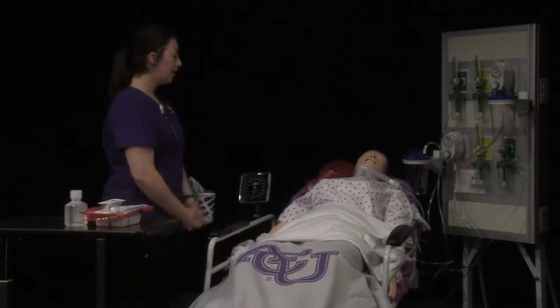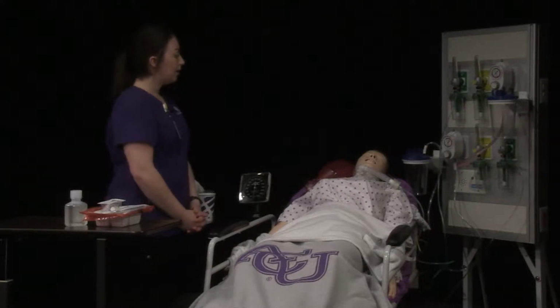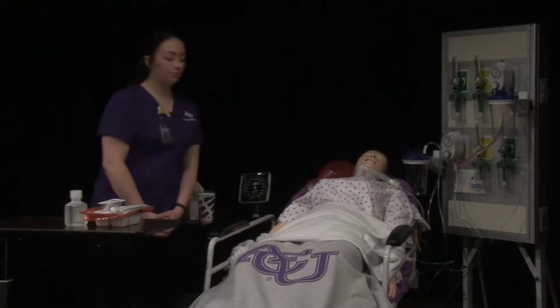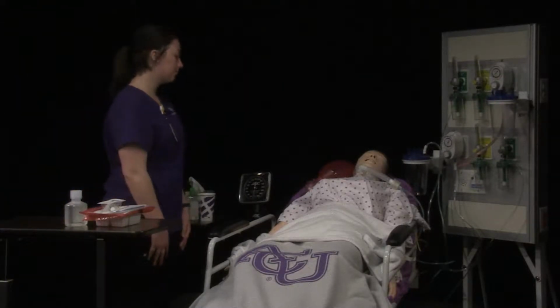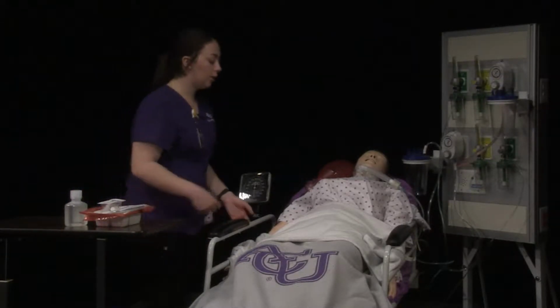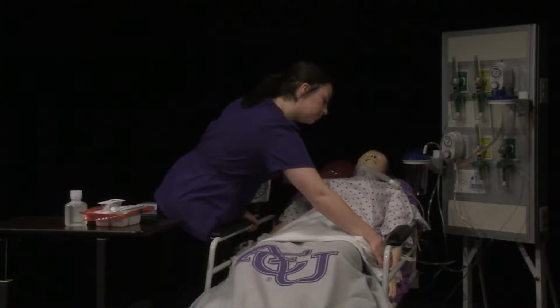Introduce self. Hi, my name's Sarah. I'm going to be your student nurse today. Provide for privacy. I'm going to go ahead and shut your door for some privacy. Identify the patient using 2 identifiers. Can you go ahead and tell me your name and your date of birth? Have the patient state their name and date of birth as you verify information with the armband.